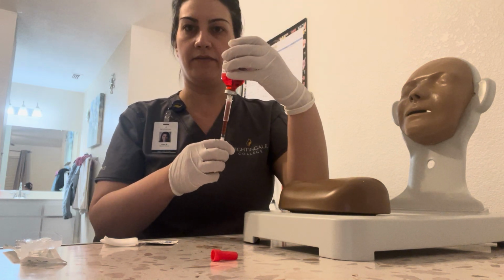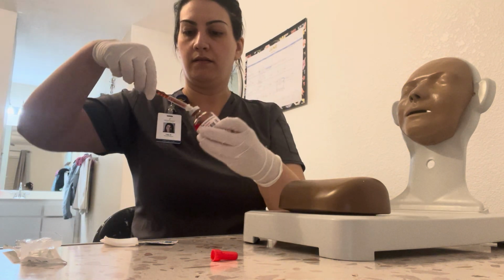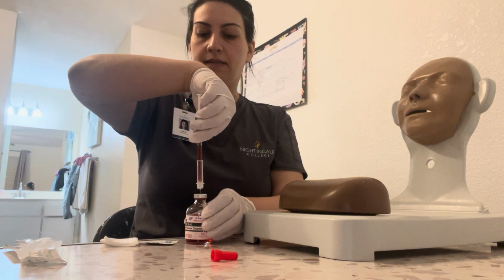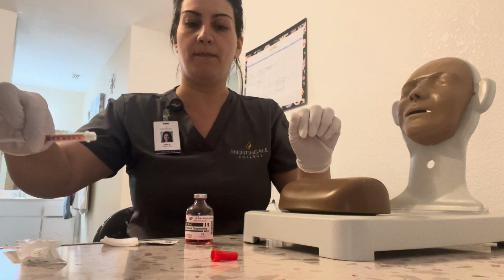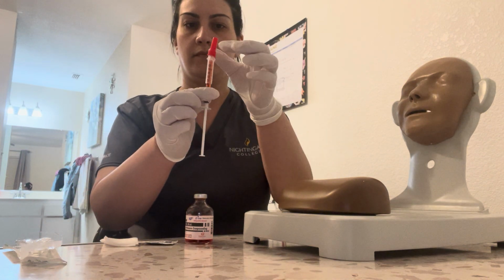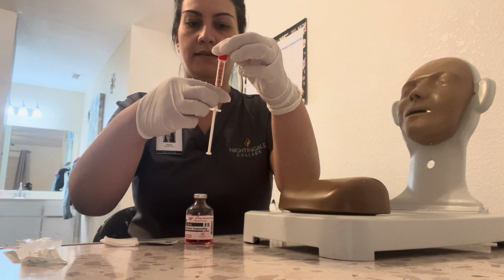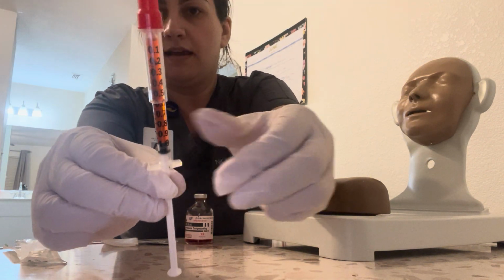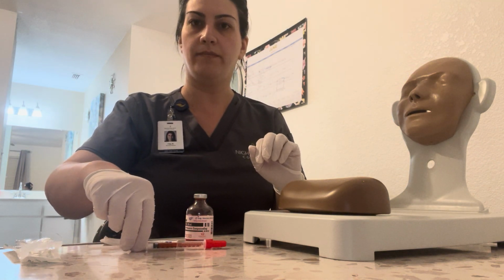We want to tap if there's any bubbles, in case there's no bubbles. We're going to take this out, and in this case, we're going to use the 1 scoop method. Go ahead and close it here, and I'm going to show you guys. So it's 1.0 milliliters. Show the camera here. All right, perfect. That is ready to go.